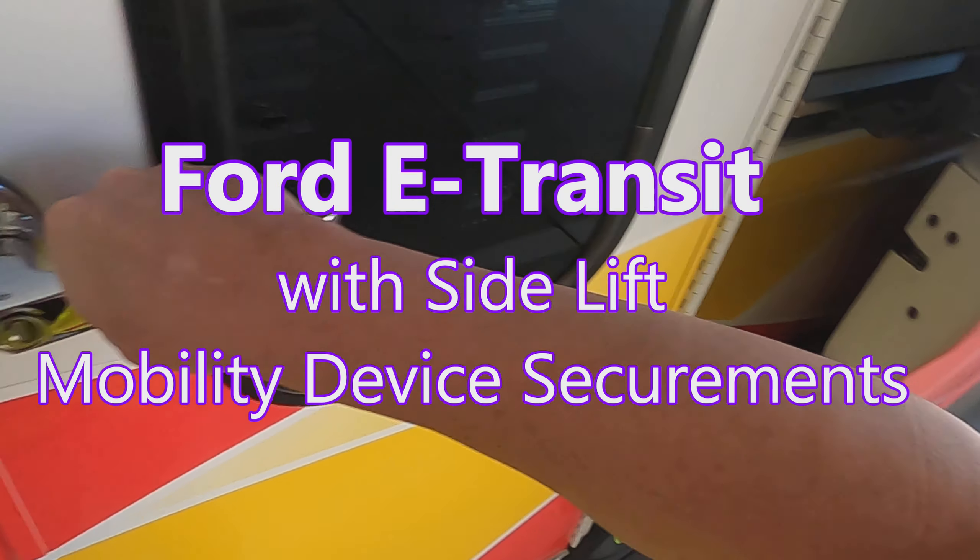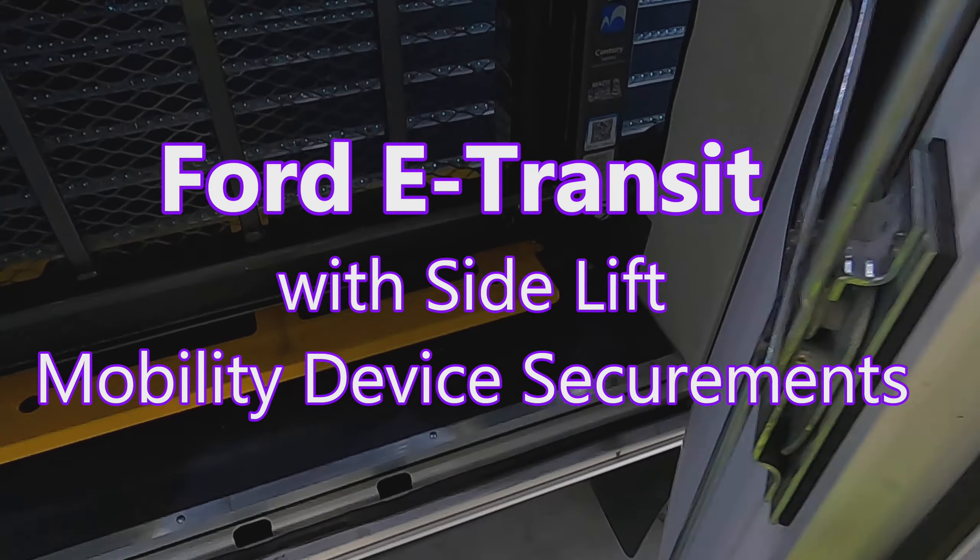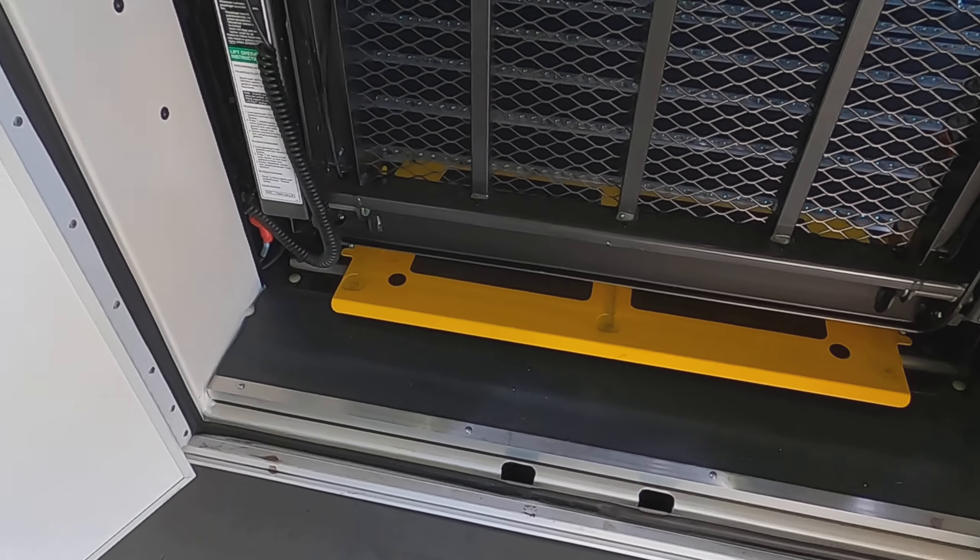Hello there. I'm Jody and I'm going to give you some tips for securing mobility devices in a Ford E-Transit with a side lift.